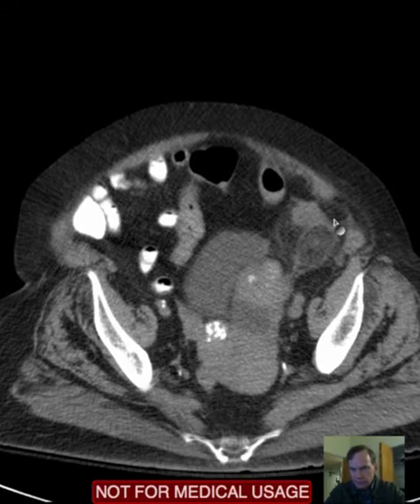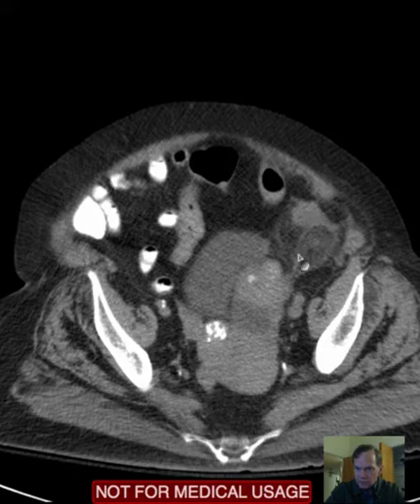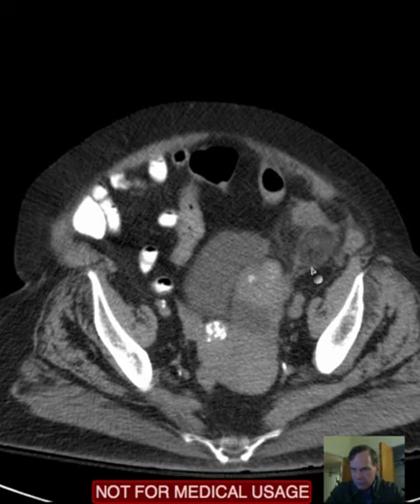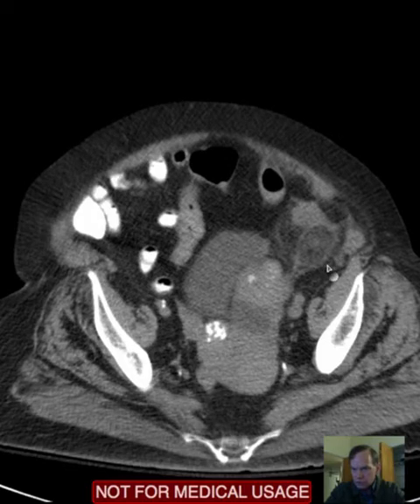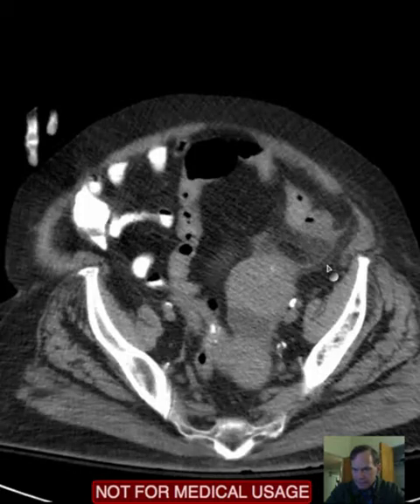So a very reasonable thought would be: is this sigmoid diverticulitis? Well, that certainly is a consideration. However, once again notice that this is not soft tissue attenuation — it is a fatty structure with this superimposed stranding primarily in this lobular type of configuration mass here, with more mild stranding adjacent to it.